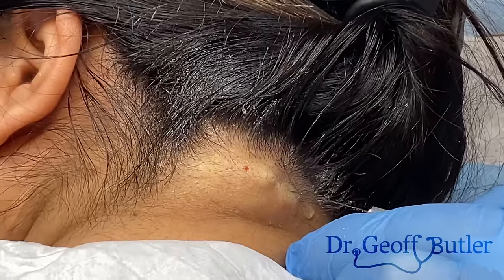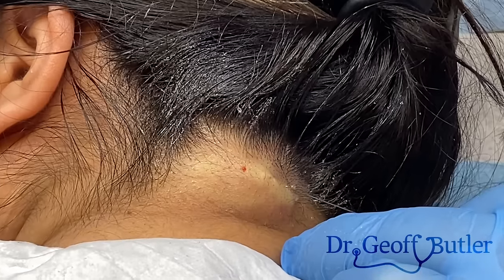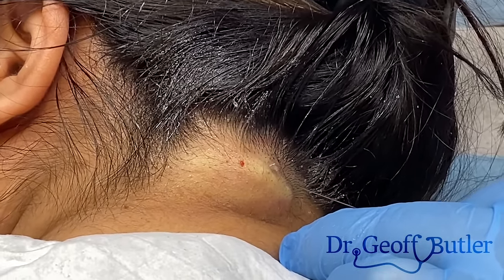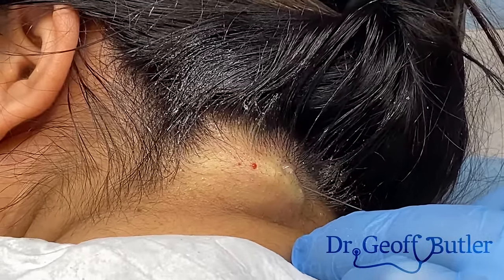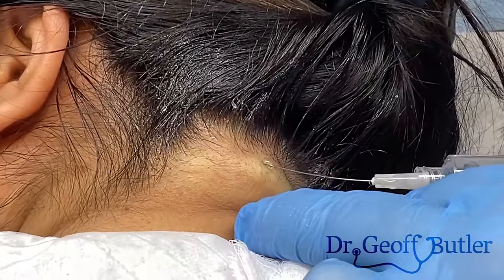And in this particular case, Dr. Jane, can we take this capsule out? It's going to be very friable and it won't be possible to. So in these cases, this is where we want to just make sure we open this up, clean it out, so that it has a chance to settle down, that we can go back in and take it out properly down the road. Which, you know, there could be an argument about doing that before, obviously, since she's had it recur on her.